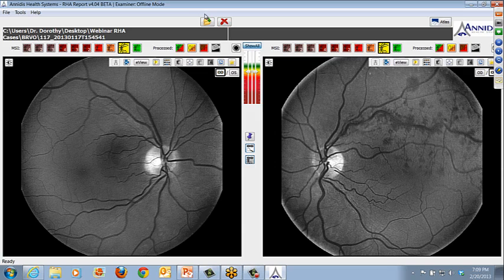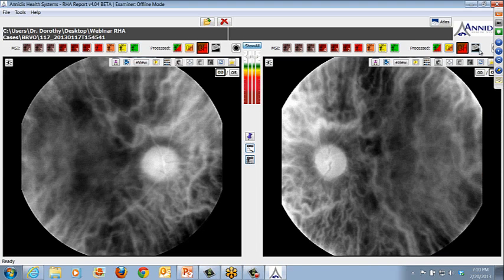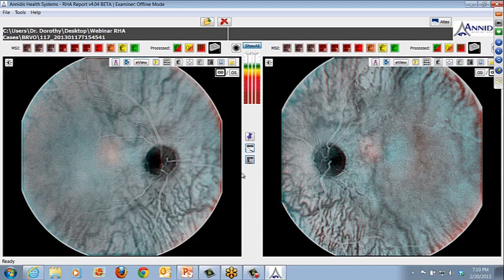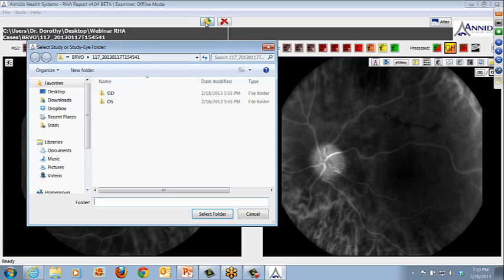Do you also suggest maybe just looking at the stereo view and seeing if there's elevation there? Yeah, you can also look at the stereo view as well. You have to remember that stereo view is created from anaglyph. So if the other views used in creating that anaglyph are not perfect, that will be off. So again, you have to go back and look at all the images and make sure that the combination that creates it is good. And I'll show you some other examples of that.